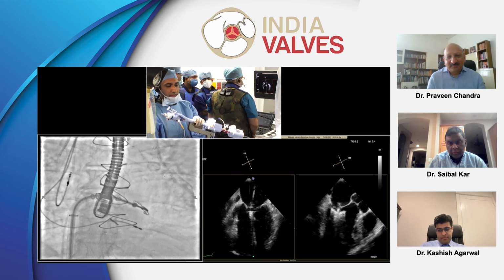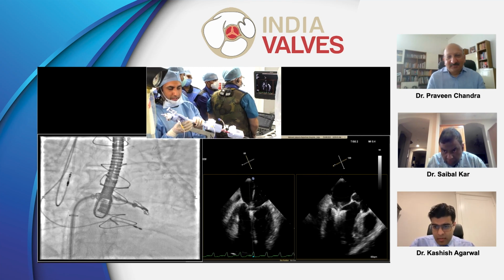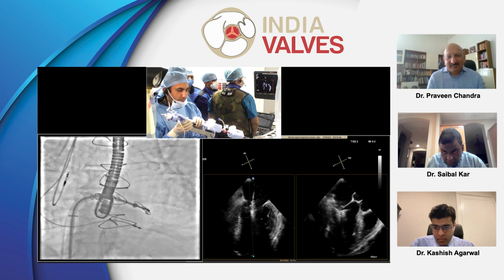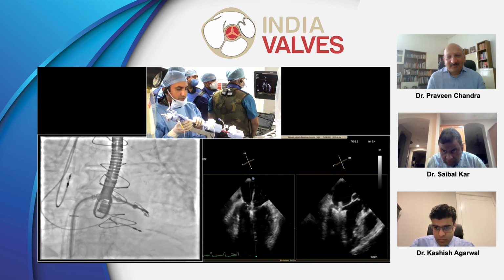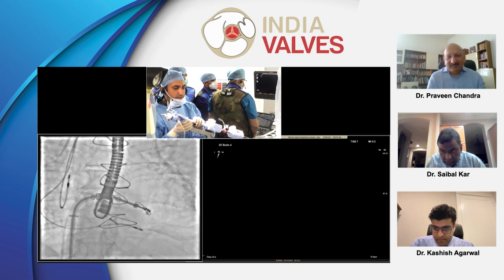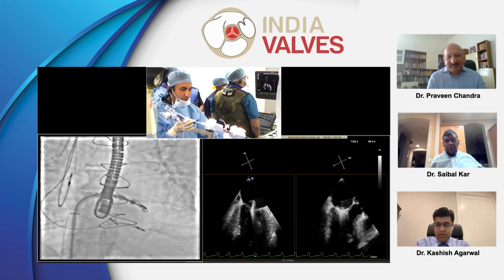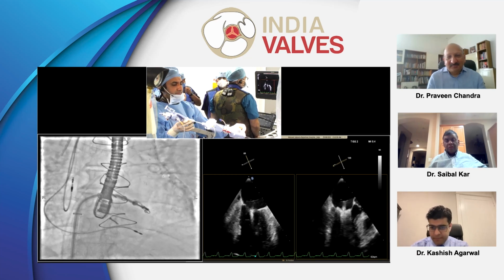And what we're doing is when we're clocking, you maintain a forward position, which is how you remove the tension from the system. Okay, put color on, Prashant. Bicom. That's the flail. So I think you go anterior. 3D, just anterior check is off. Orientation. Let's go to the 3D again.